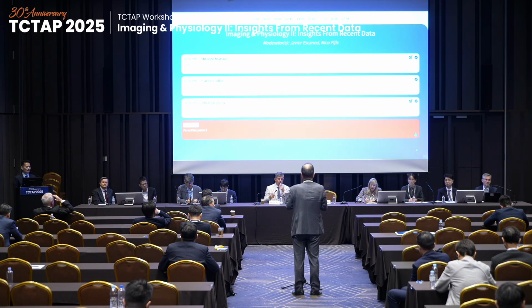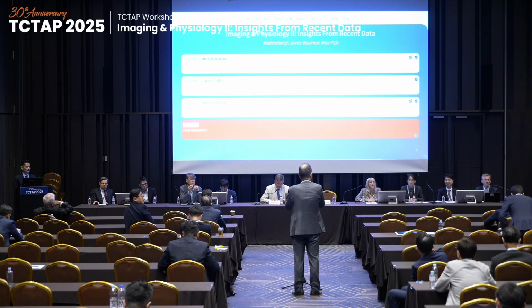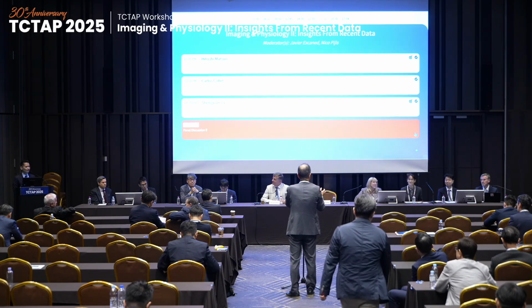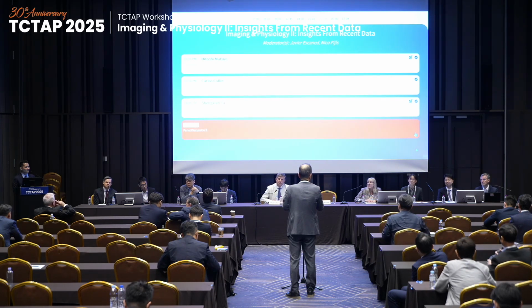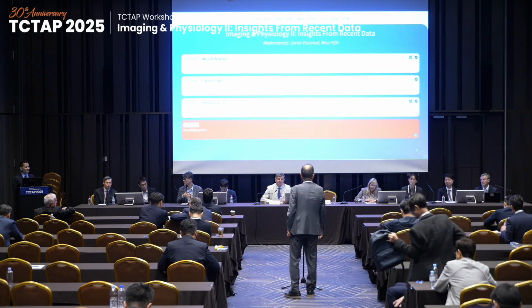However, there is no case which is completely different. The majority of the cases we can measure by the functional coronary angiography. Some limitations of the functional coronary angiography: anatomically, it is very difficult to measure the ostial region with this technology. This is one of the limitations. Okay. Thank you.